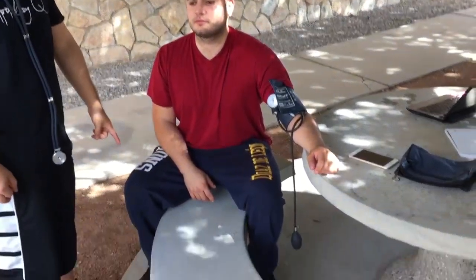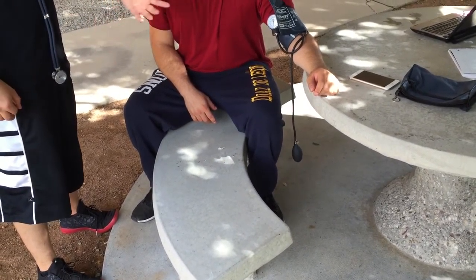Hello everybody, my name is John and today I'm going to be teaching you how to take a blood pressure reading. My subject is sitting upright, his legs are flat on the floor, his arm is at about heart level. You want to try to take the blood pressure reading on their left arm — the left arm is the best arm.